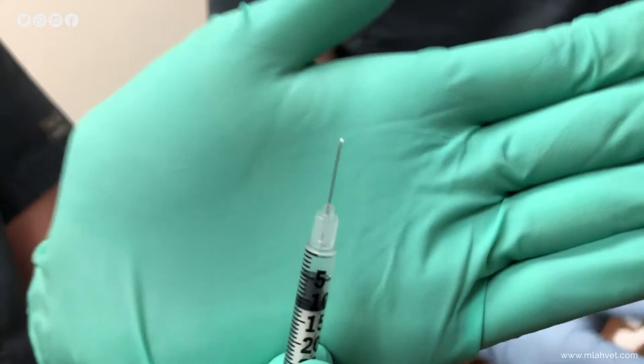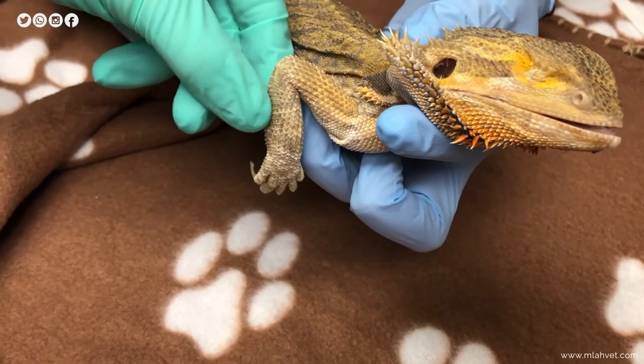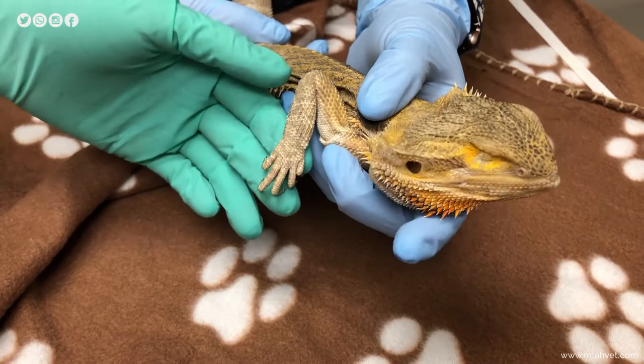When we go into the body we're going to go into the muscle. When you feel your reptile you can feel the elbow and it's kind of bony — that's not where you want to go. If you feel down a little further you'll feel the muscle; it should feel nice and dense. That's where we're going to be giving the injection.